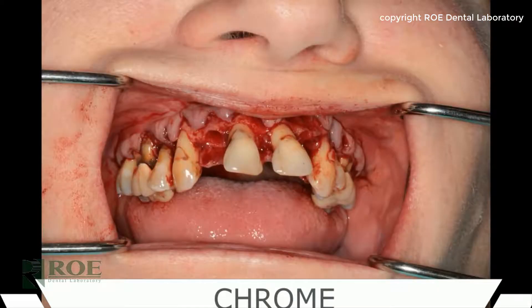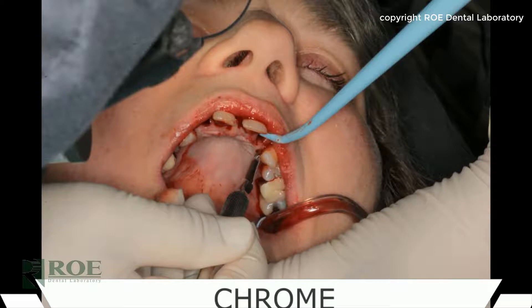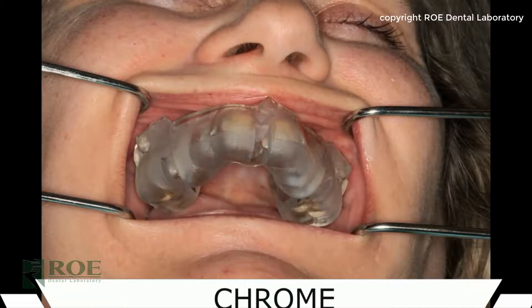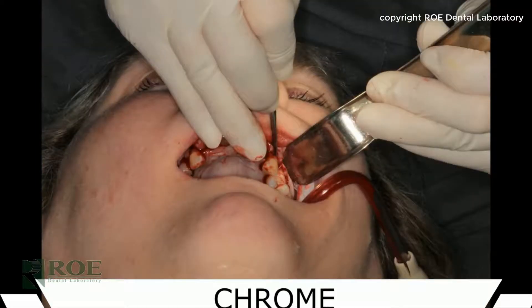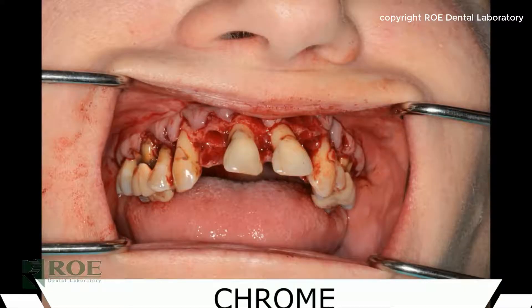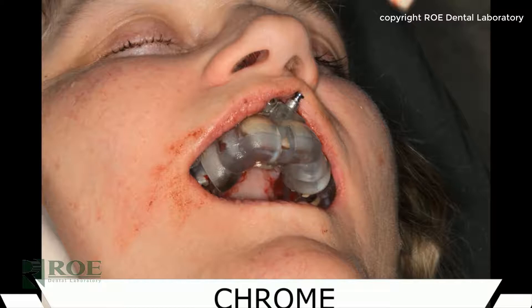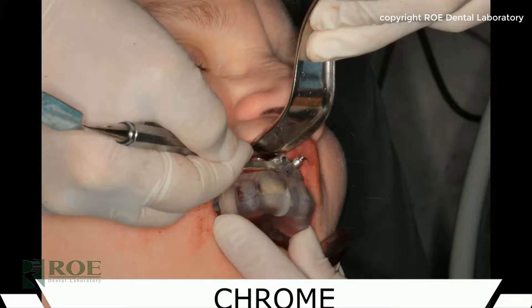Once confirmed, the pin guide is removed. In this case there was some malocclusion, so the teeth that were in the way of the pin guide were extracted. Once extracted, the doctor flapped the labial tissue all the way up to the top of where the fixation base will be. With the tissue held out of the way, the pin guide is assembled with the fixation base and then reinserted back into the mouth.